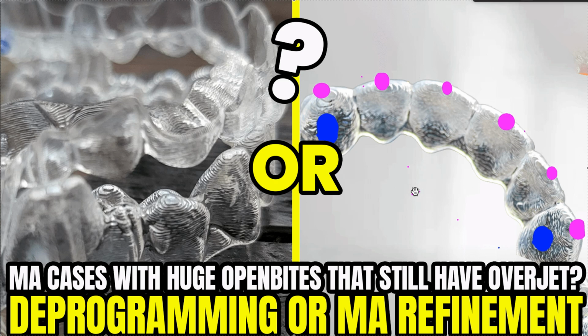But I've had this situation, and on most of the cases I've seen, it's worked out great. By the time we got such a massive open bite, we had corrected the AP, we had corrected the sagittal, and now it's all good. The overjet is gone. So all we have to do is deprogram and close the open bite, finish, and we're done, whether this is phase 1 or phase 2.